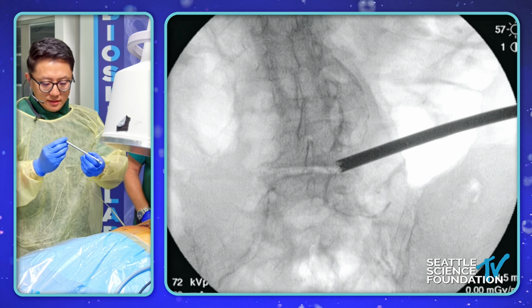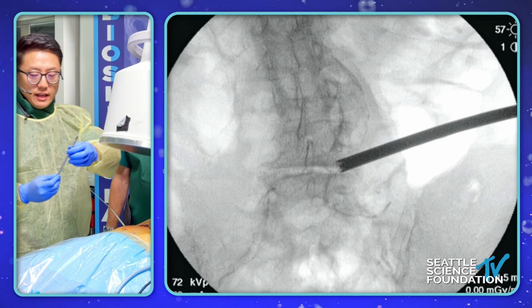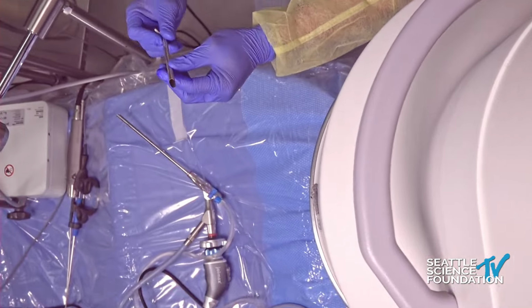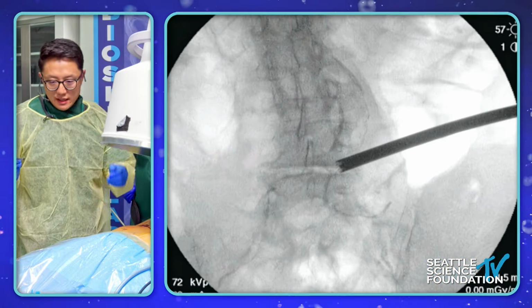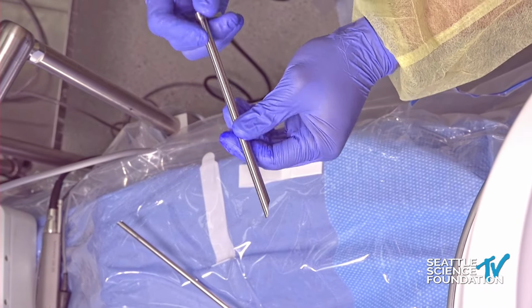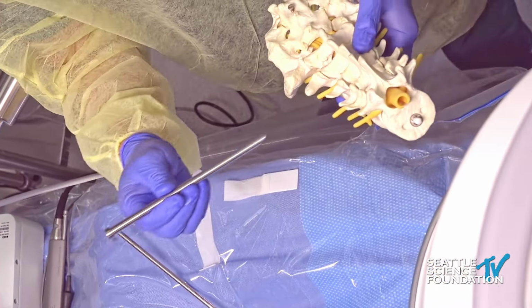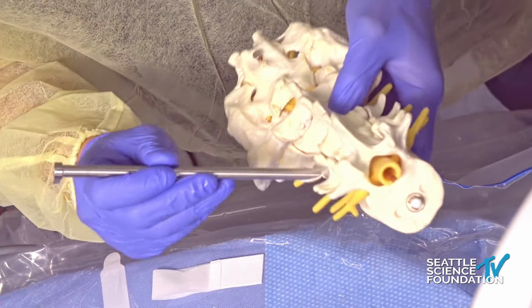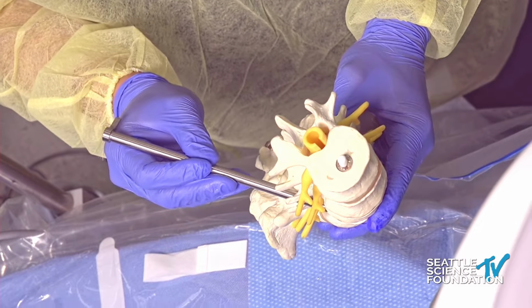This is the regular one? Okay. This working channel, you can see, is beveled. And so this bevel allows you to do several things. You can actually get underneath the traversing nerve root and land on the disc. So what you can do is land on the disc and retract the traversing nerve root. If you're working outside of the foramen, you can find the exiting nerve root and rotate it out of the way.